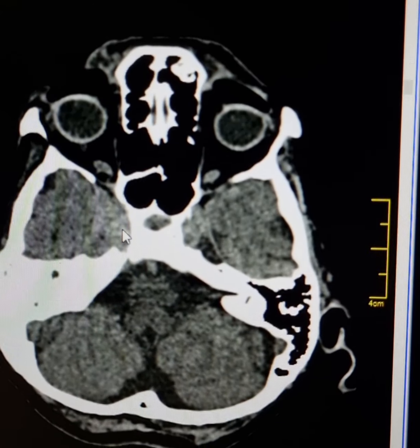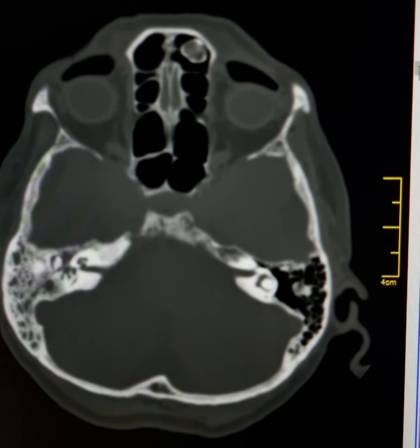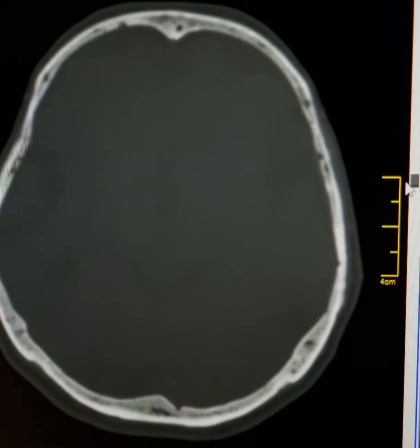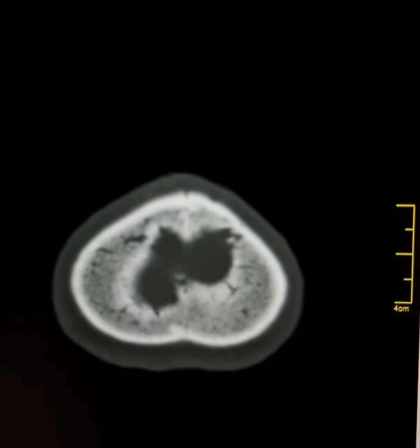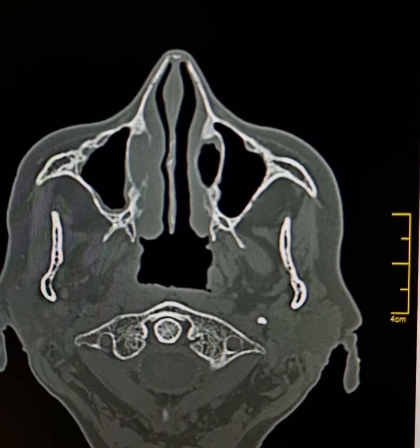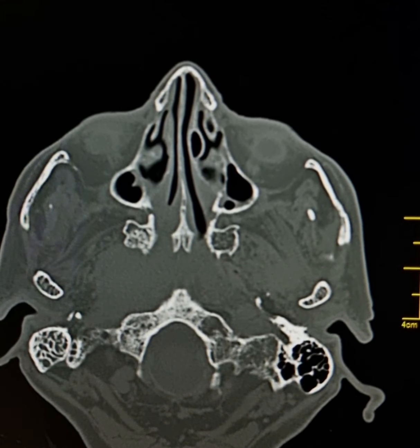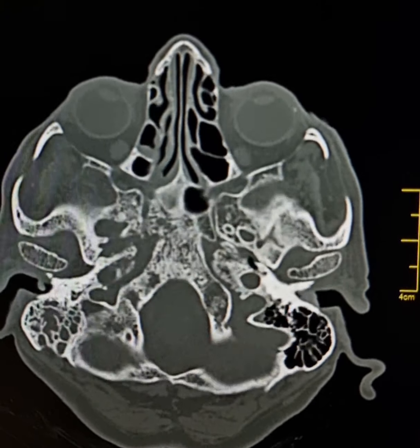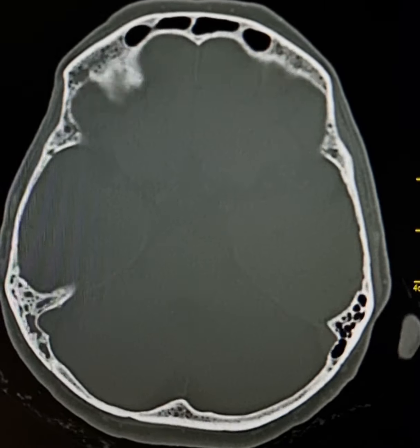Now this mass is in the right parasellar region. Please observe there are lytic and sclerotic lesions involving the whole of the skull. These most probably represent metastatic lesions. On the bone window, you can see lytic and sclerotic lesions involving all of the bones at the base of skull — the clivus, petrous parts of the temporal bone, and calvarium.